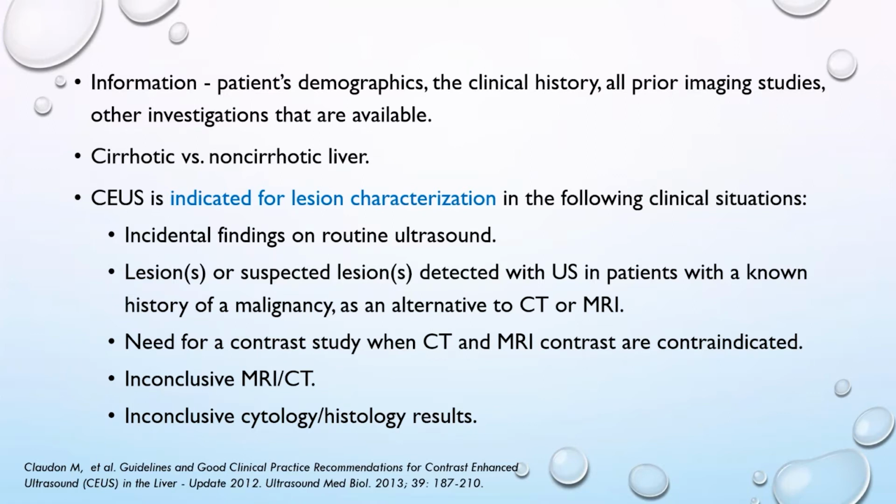And here it is a very good method because it adds only 5 minutes if you can do it at the same time as the ultrasound study, and you are going to be able to give your patient more information regarding the lesion that you have detected.